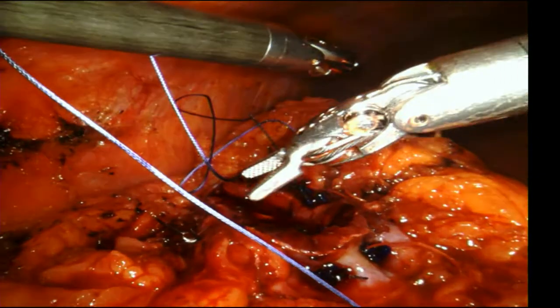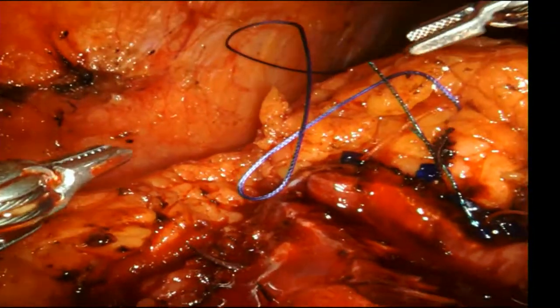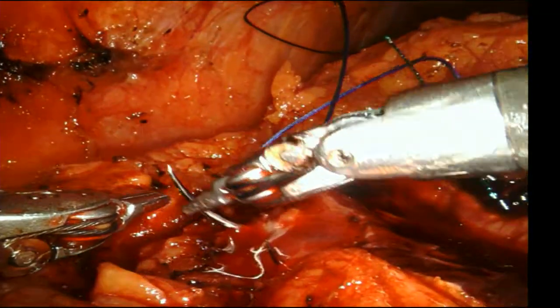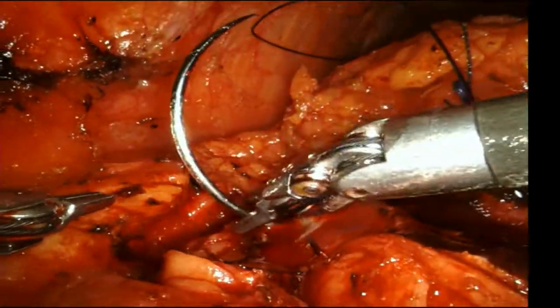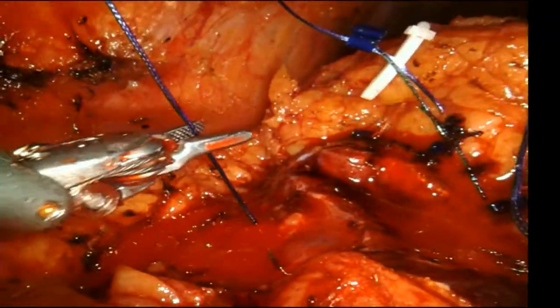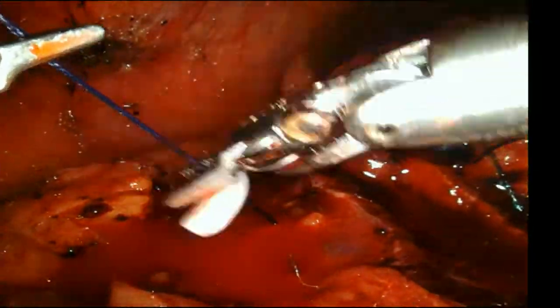But how often do you do those? We rarely use the CT1. This is the most common one I use, the medium. And then the larger one is a CTX needle. One step up from this is the XLH. The XLH needle is a huge needle. It's the biggest needle you'll find anywhere. But the idea is that you can even do a heminephrectomy. You can get an XLH needle to go all the way across the defect.